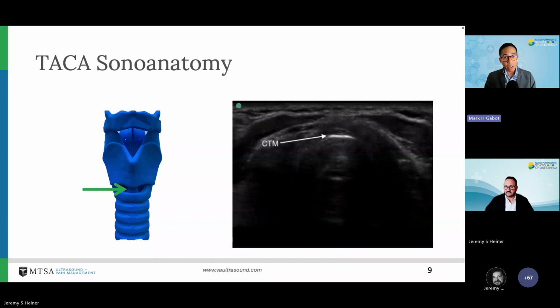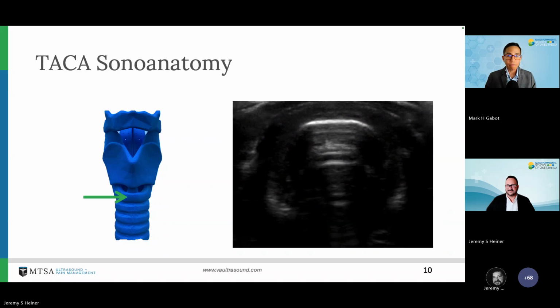When I teach airway ultrasound to students at KP School of Anesthesia, I want to always emphasize that we're not always looking for the perfect textbook image. What we're doing is actually looking at relationships to structures, because again, a lot of these patients that are going to be having difficulty with airways are not going to have straightforward airway anatomy. We're trying to look for relationships between the thyroid, cricoid cartilages, and that tissue in between those two. Next slide, please.